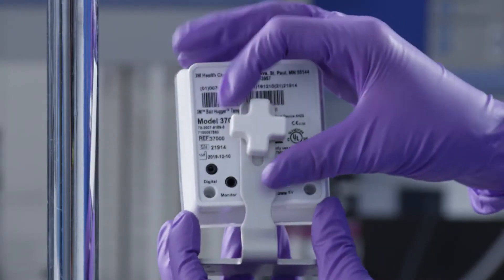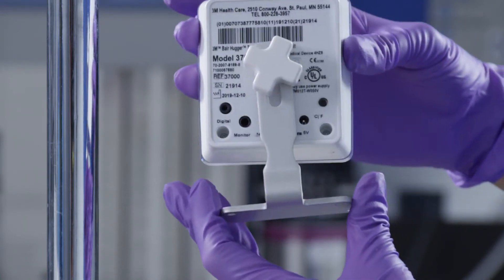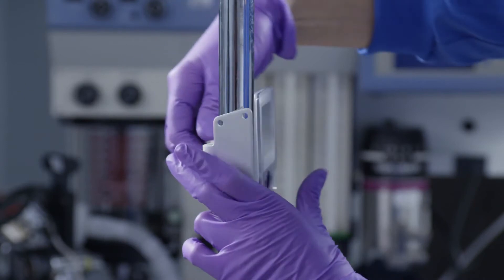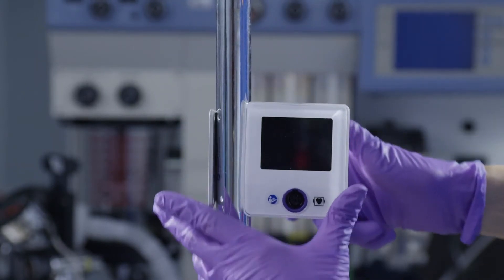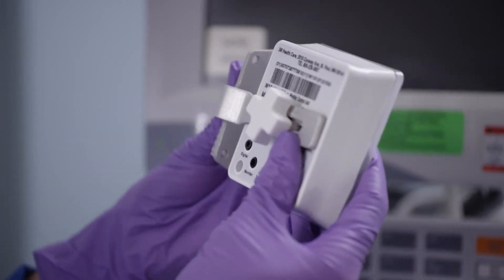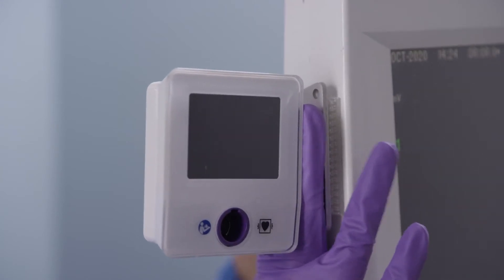To begin, mount the control unit. There are several options. A knob on the back of the control unit allows you to adjust the height and orientation as well as for securement to an IV pole. Another option is to work with the Biomed technicians at your facility to mount the control unit to the patient monitor or other desired location in the care setting.